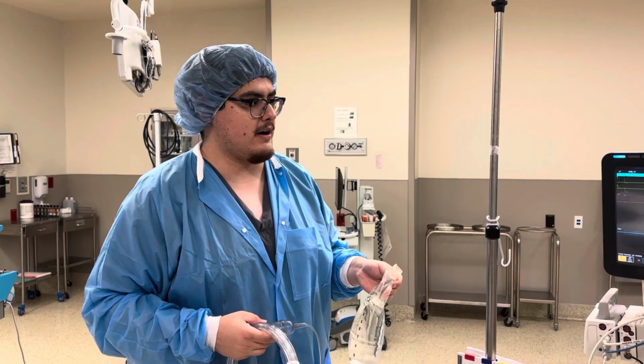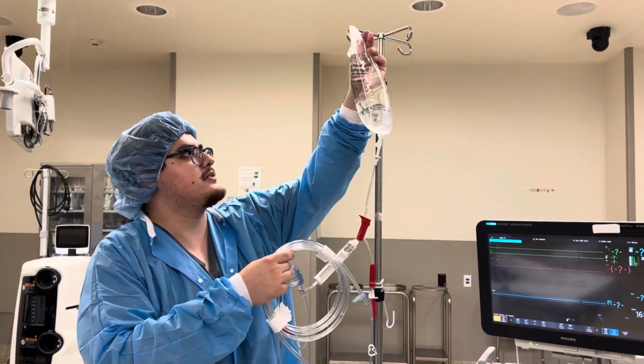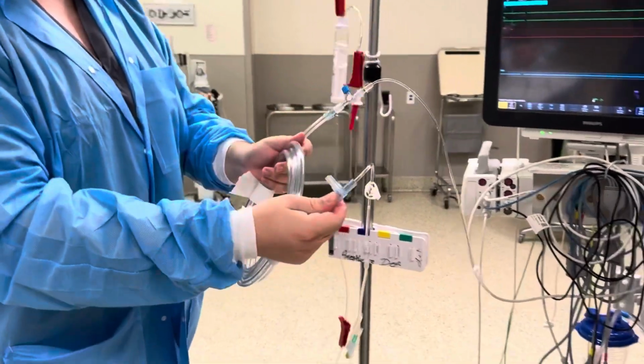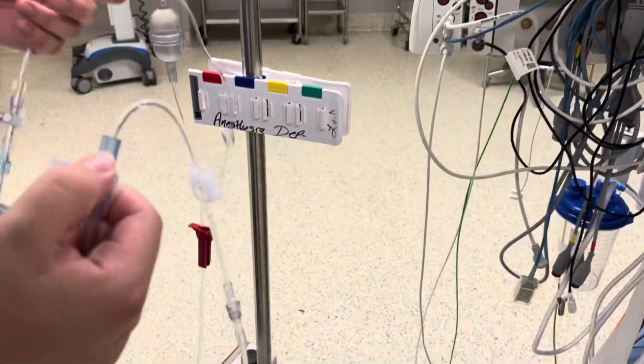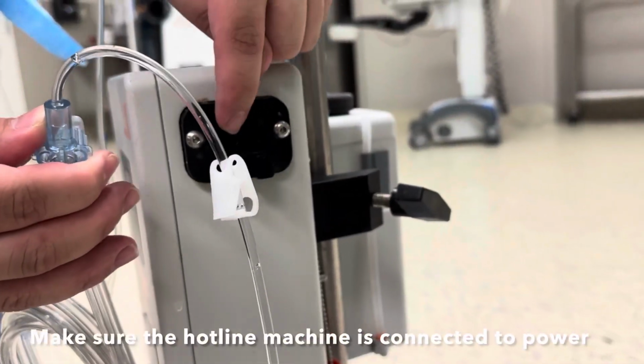All right, so now we're going to hook up our hotline to our hotline box. So just hang this on our IV pole. Then we're going to take our hotline tubing. It gives us two ports right here. We're going to connect those two prongs to our hotline box. So come down here. You see these two holes right here.